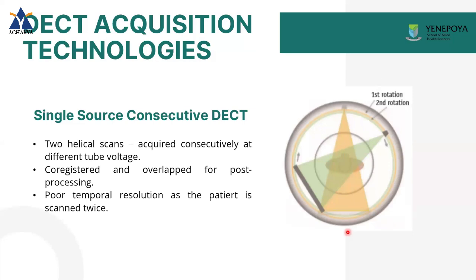Next, we have single source consecutive dual energy CT. This type of CT is there in some of the hospitals.